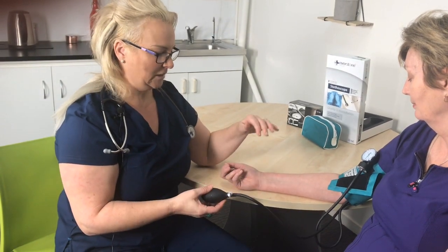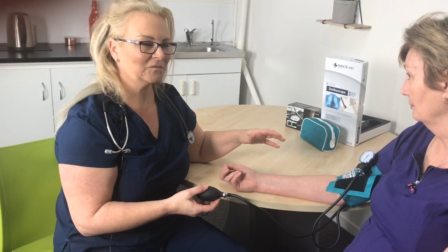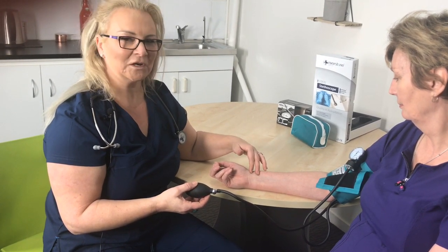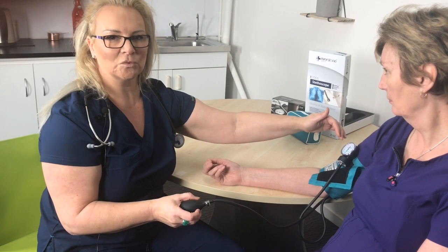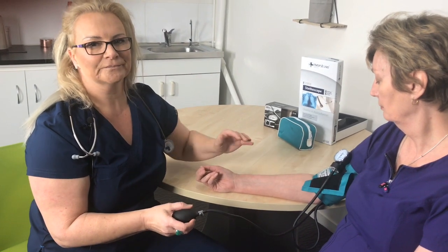The key things to remember: check the radial pulse first so you've got an idea of what the top systolic will be, so you're not over-inflating the cuff — there's nothing worse than having the cuff inflated up to 200, it hurts quite a bit. Only go as high as necessary. Once you've felt the radial pulse disappear, that lets you know how high to pump for the actual recording — always go about 20 millimetres of mercury higher than when that pulse stopped. Then lefty-loosey to allow air to escape slowly. Systolic is the top number; you'll hear it pulsating down, and when it gets to the diastolic, it disappears. And that's your blood pressure.